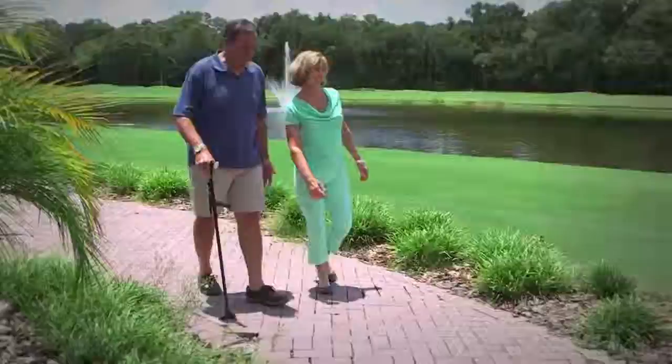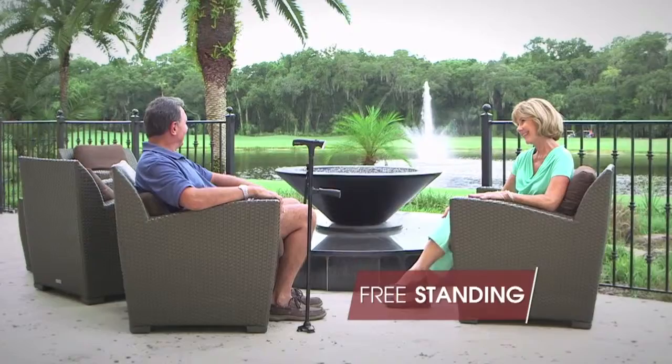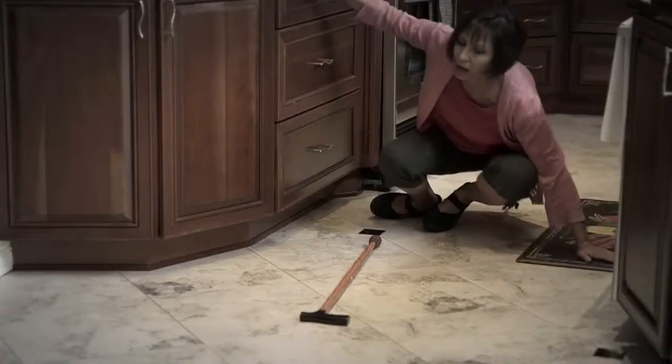The Clever Cane has a durable all-terrain base for gripping support on uneven ground and slippery floors. The secret is the extra-wide 360-degree pivoting base with three stabilizers, ensuring non-slip reliability. It's so stable, it stands by itself. Unlike those other canes that if you let them go, they fall to the ground — and that can lead to you falling and injuring yourself.